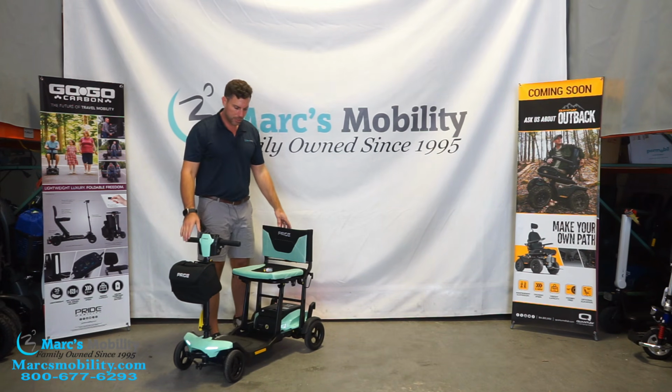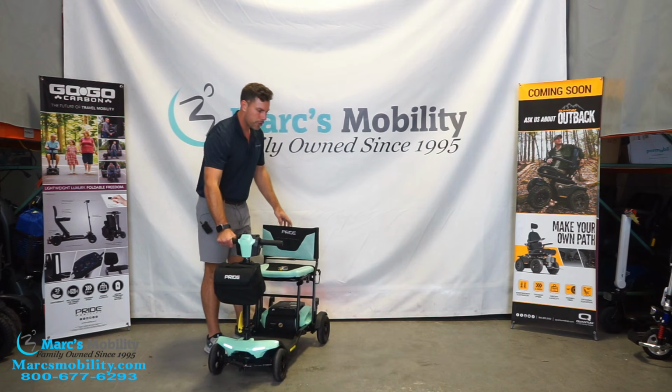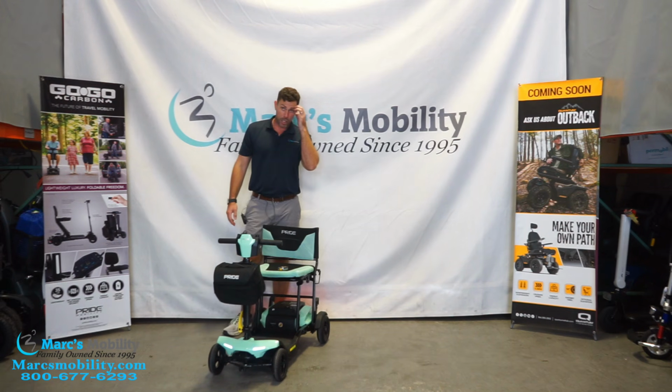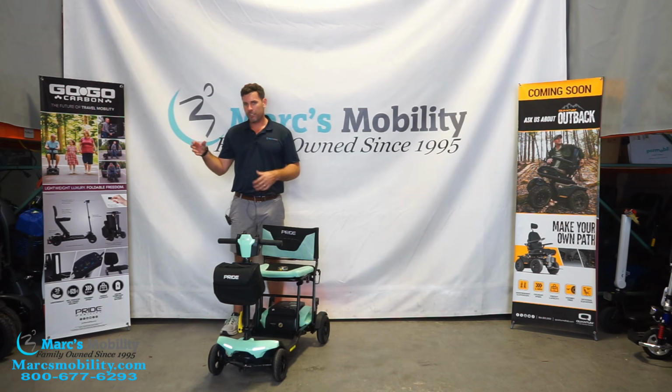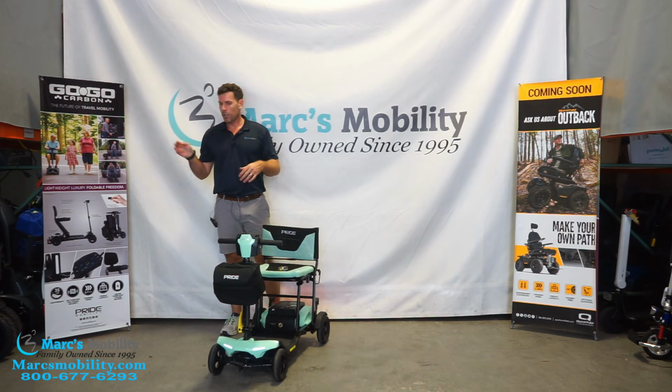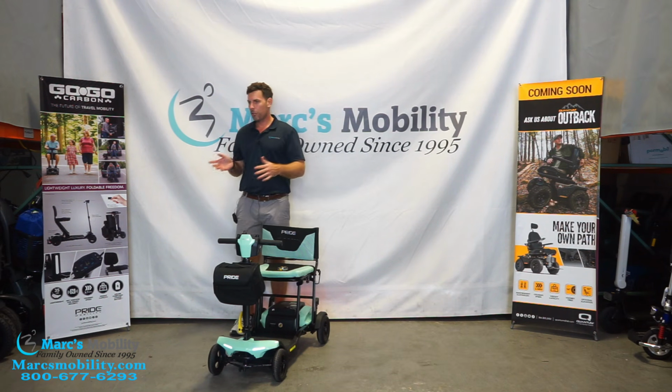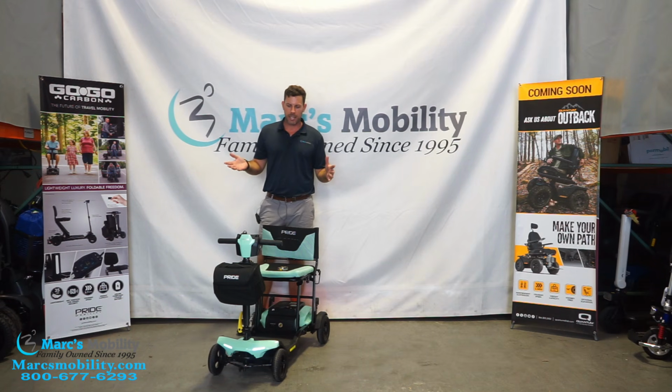Best part about lithium is too, there's no real wrong way to charge the battery. So if you want to short charge it, you want to charge it for 30 minutes before you go, go ahead. You want to top it off because it's 90% full for the next day, go ahead. The only thing you don't want to do is let the battery sit for months and months at a low charge because that could potentially ruin the battery. But as long as you're charging this somewhat regularly, you cannot go wrong. If you want to drain them down, charge them up, or just constantly top it off every night, like some people do that are a little bit nervous, you're not going to harm the battery. So that is a big advantage of lithium.